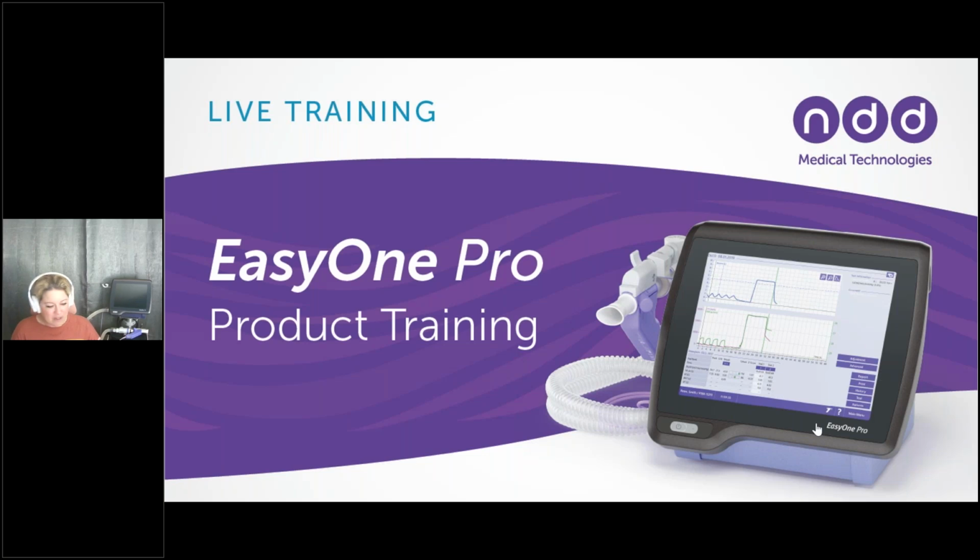But trying to think about other things with the Pro and Pro Lab devices. One question that we do get sometimes is what is the difference between the Pro and Pro Lab? So the Pro and the Pro Lab are almost identical devices. The only difference is the Pro Lab has one additional test, which is that nitrogen washout or multiple breath washout test for lung volumes. Other than that, the devices are identical. They do the same tests. Everything looks the same with the exception of the Lab having that washout test.